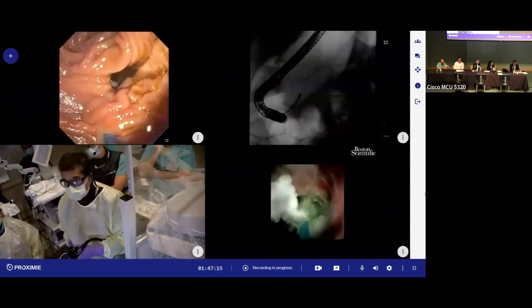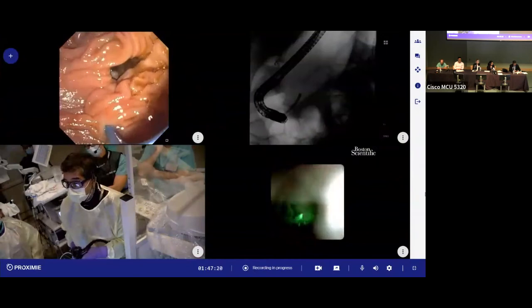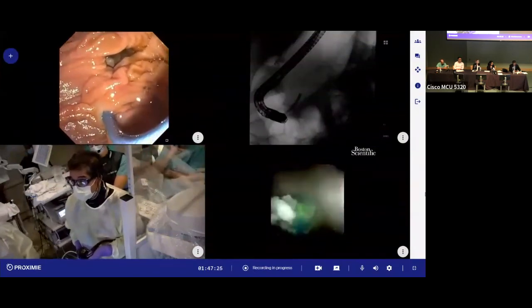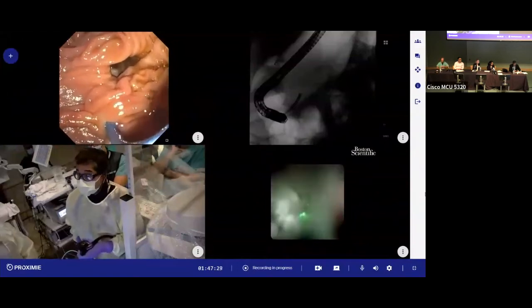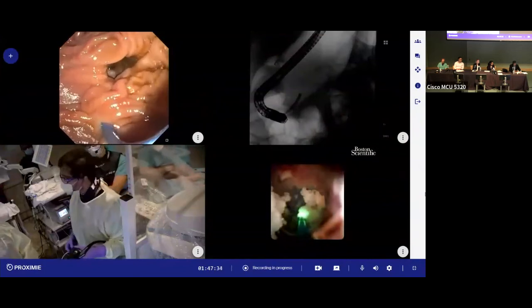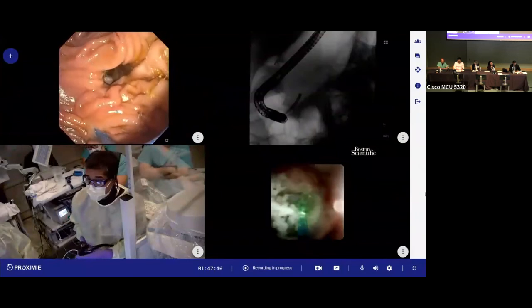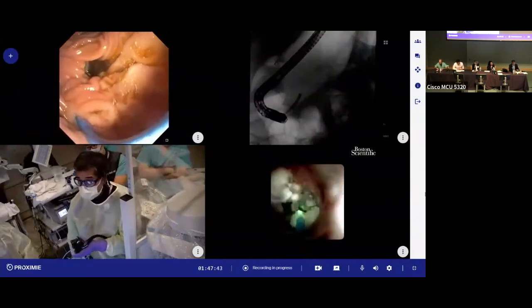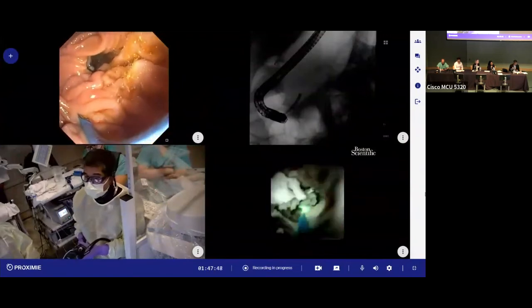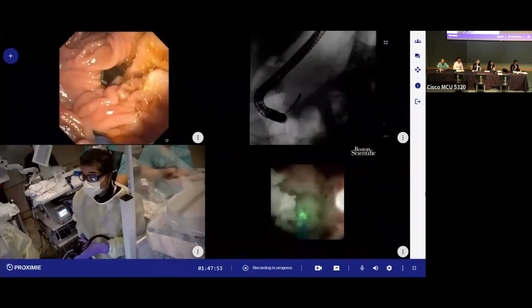Okay. So then I think what we try to do is get the stone fragments to about under 3 millimeters. But we're basically decompressing the duct here. There are several mechanisms of pain in chronic pancreatitis, but I think we're going to talk about this at our talk. I think Dr. Easter is talking about PD stones tomorrow. But PD stones cause ductal hypertension, and that's what we're trying to reduce, theoretically. I'm sure it's much more complicated than that. We'll learn about that tomorrow. But we're just trying to fragment up the stones, and then we're going to gain access to the upstream.